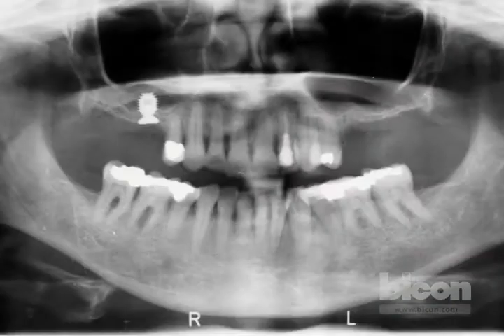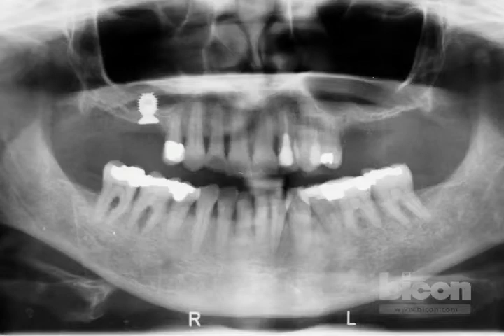We will still use a graft. If you look at this x-ray, on the right side, the 6 by 5.7 millimeter implant that appears to have a temporary abutment is actually placed with that technique. So we're going to do the left side with that same technique.